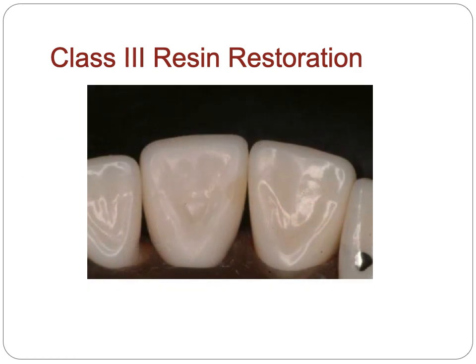As you see, we have a good contour, good finishing, good polishing. There is no underfill or overfill of the restoration, and the restoration returns all the missing part of the structure to the normal shape and normal anatomy.